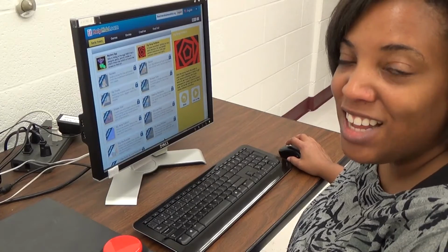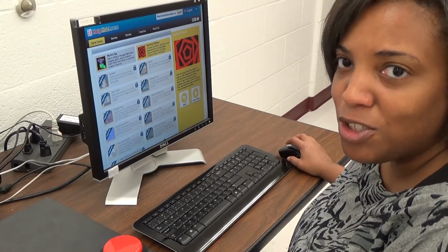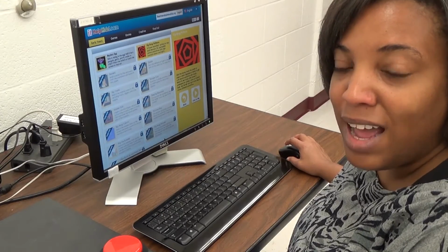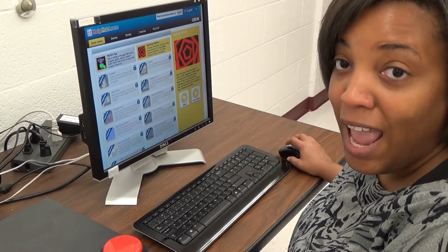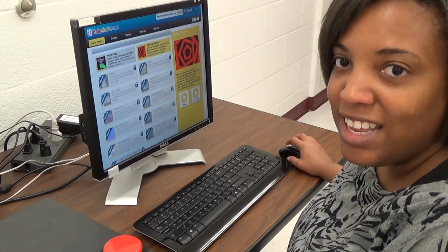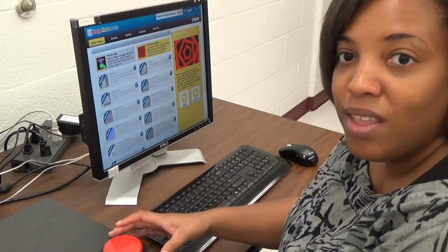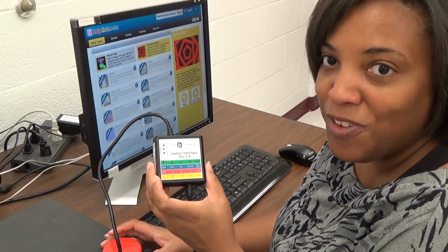Help Kids Learn has lots of games for cause and effect and for switch use. Give it a shot. It's www.helpkidzlearn.com. Well, I hope you learned a lot about using switch interfaces today.